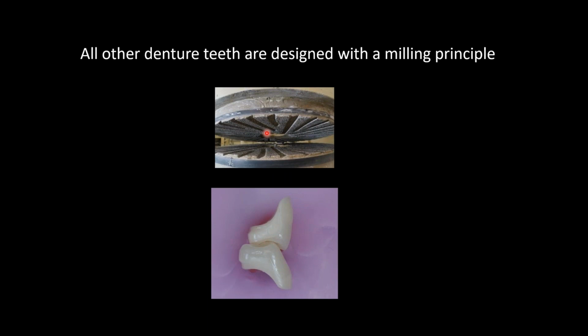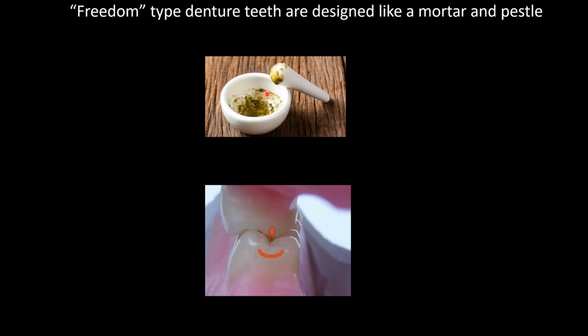So when I looked at the teeth, I thought, well, geez, it's a lot like a mill perspective, like flour. The cusps are flatter, and look at how everything contacts. The teeth have to come together and grind against each other to mince the food apart. That was the biggest change when you jump philosophies to the mortar and pestle. Again, the cusp sits in the bowl. It's the same thing here. There's the cusp, it sits in the bowl, and the bowl brings the food up and it gets crushed by the tooth. But you see there's more gapping here.